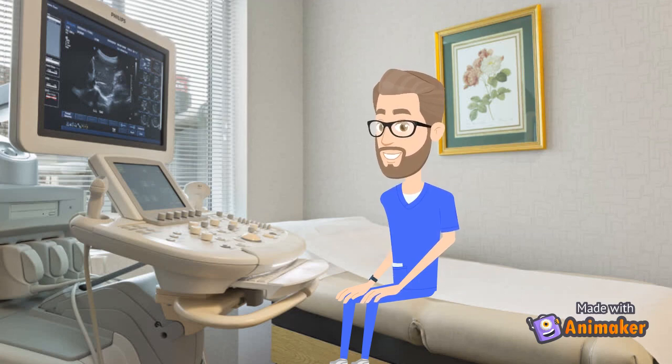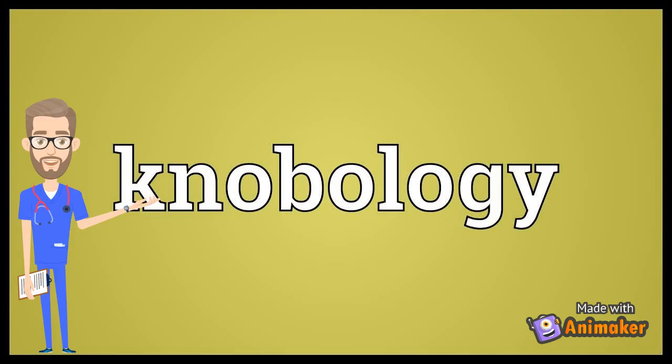Let's get started. Knobology describes the manipulation of ultrasound knobs and controls in order to obtain the best image possible for the scans you are performing. The inadequate use of these knobs and controls may impair image quality and can result in misdiagnosis.